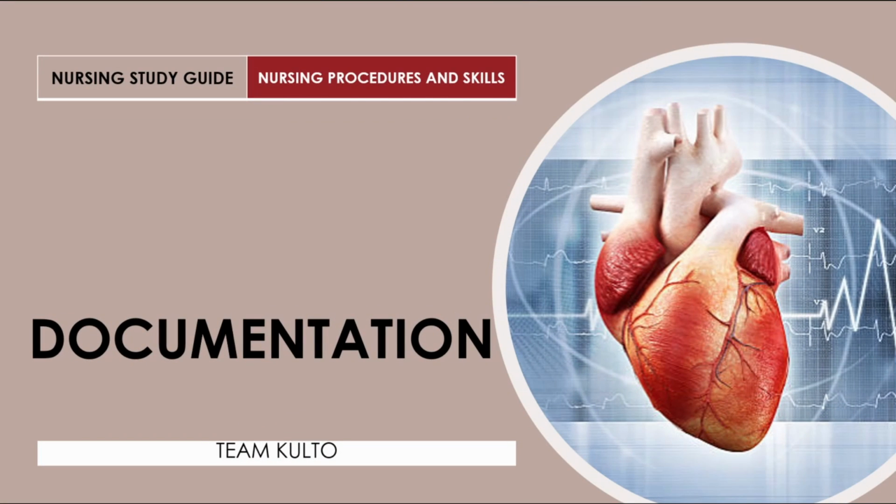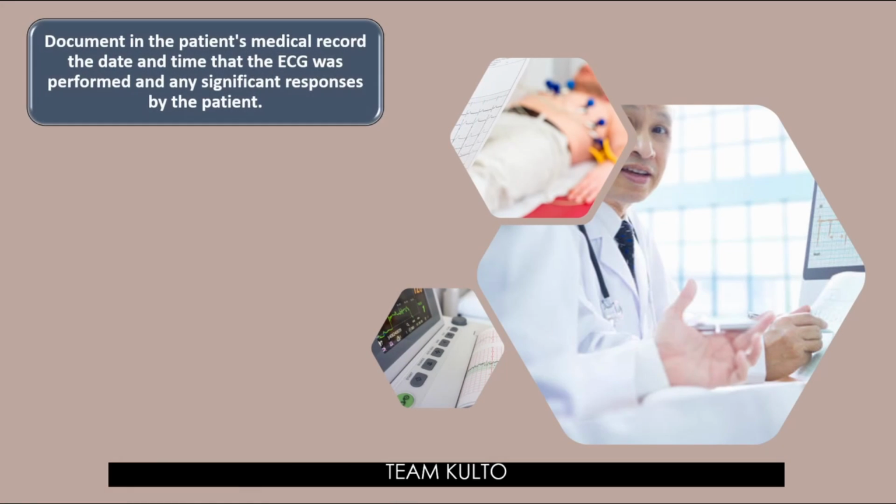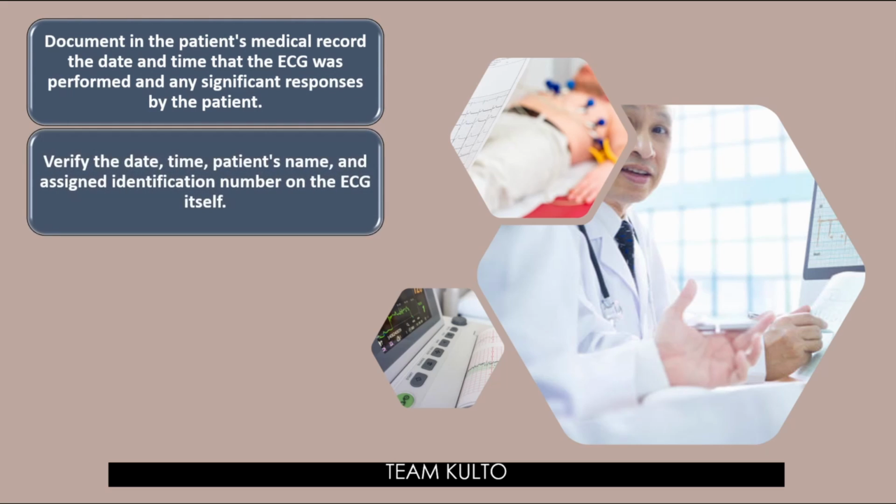Paano mo siya ido-document? Malapit na tayo. Paano documentation mo ng ECG reading? Ito siya. Sabi ko sa inyo, I got you eh. Okay, first one, document in the patient's medical record the date and the time the ECG was performed and any significant responses by the patient. Verify the date, time, and the patient's name and assign the identification number on the ECG itself.